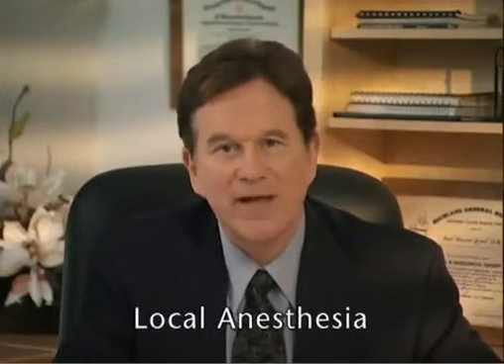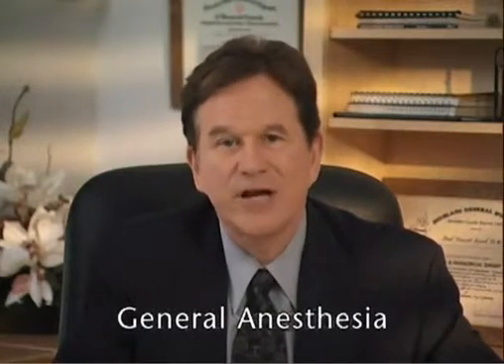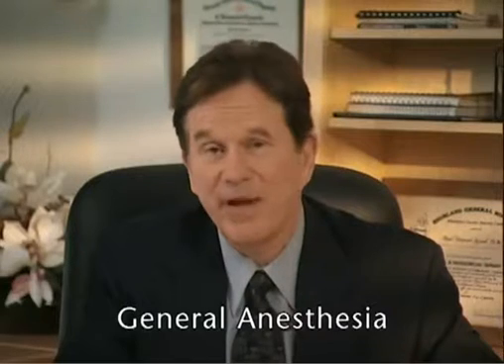Dental implant surgery can take place in either the oral surgeon's office or in a hospital setting. The surgery in the office is generally performed using a combination of local anesthesia and light sedation. Occasionally, general anesthesia is used, and the patient is not conscious during the surgery.